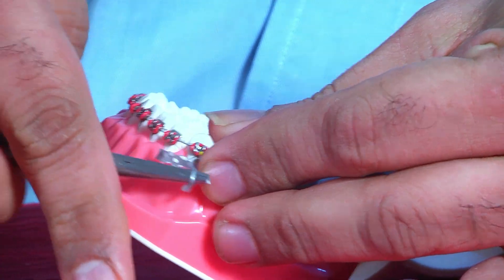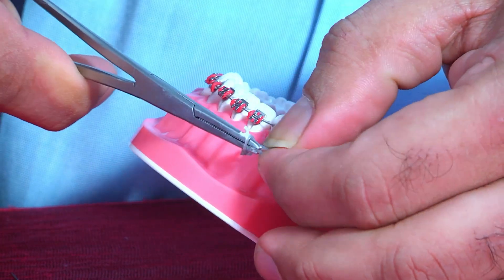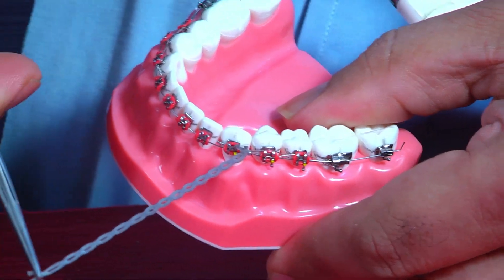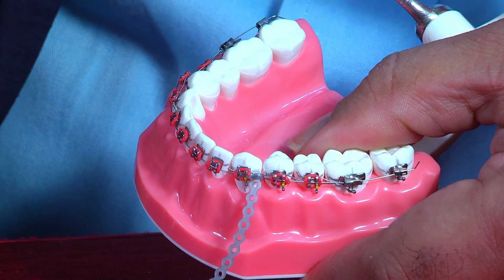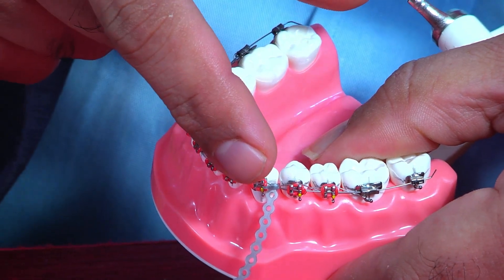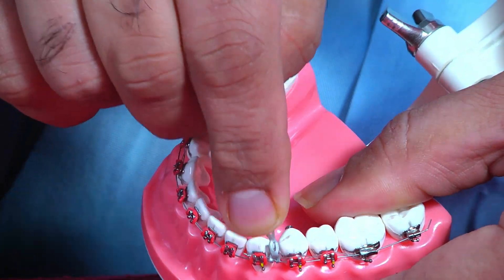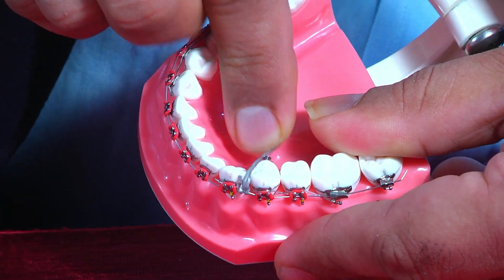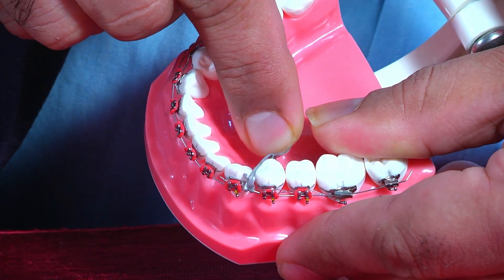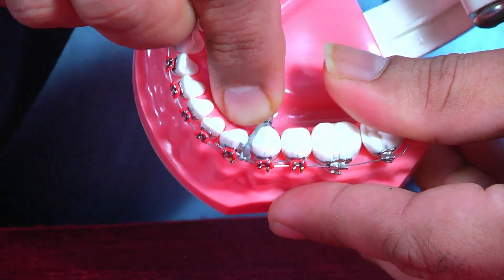Now you have one end here. Again, rotation correction is by force couple — you have two forces. A light force will give you a large moment, that is the force of rotation. Now you take this from here — it goes through the interdental, through the contact, it should go below, and then a light force here to engage the lingual button.